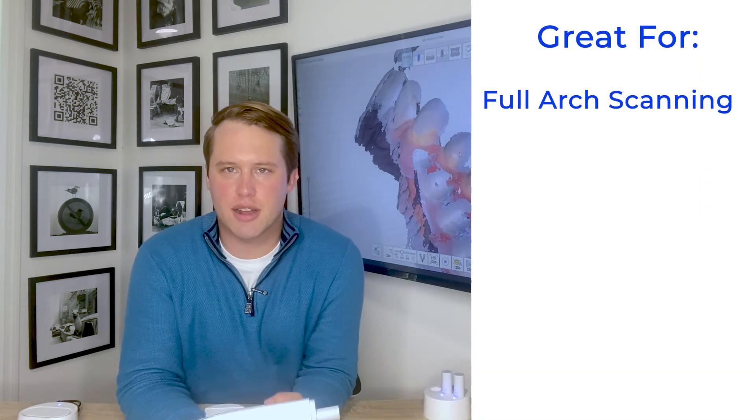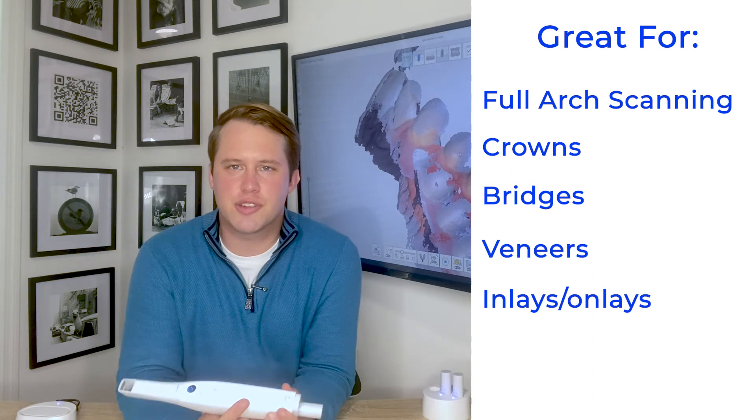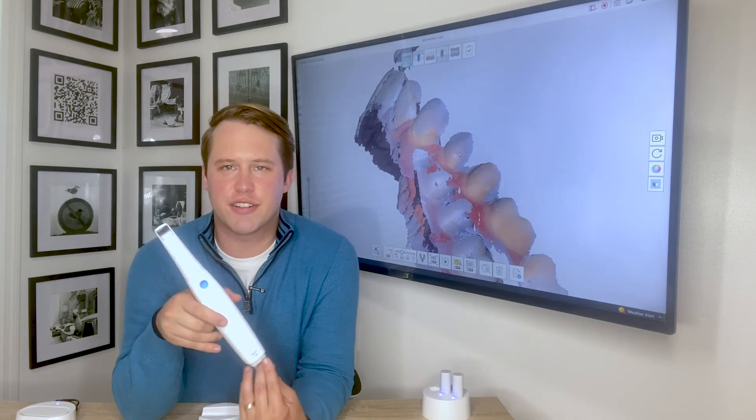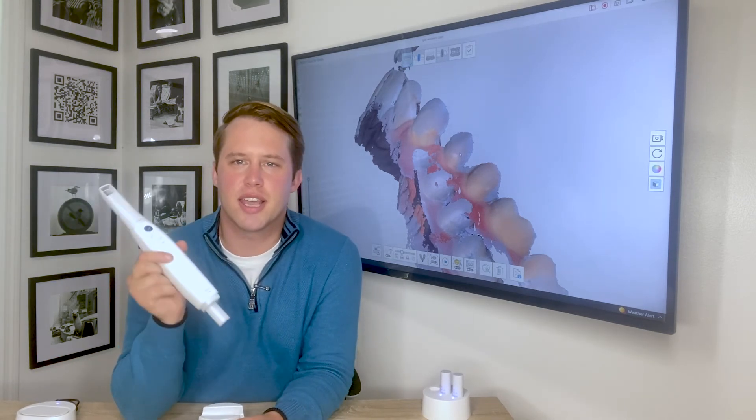Extremely fast full arch scanning capability — whether you're going to be scanning for crowns, bridges, veneers, inlays, or onlays, this scanner is capable of doing it wirelessly. Again, it's like a dog off its leash. Very fast at 70 frames per second, very lightweight, very user friendly, and highly recommended.